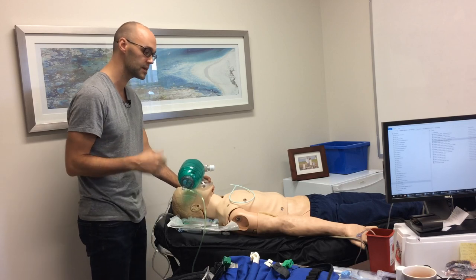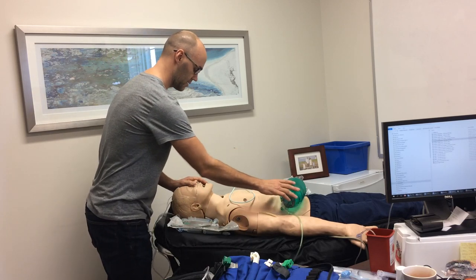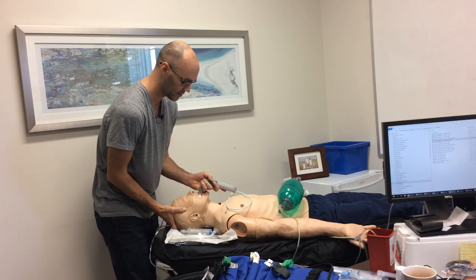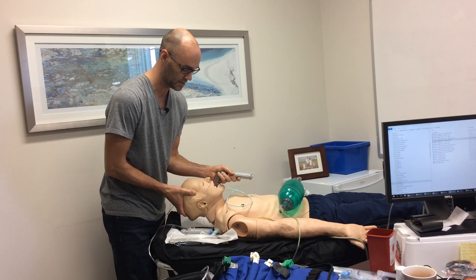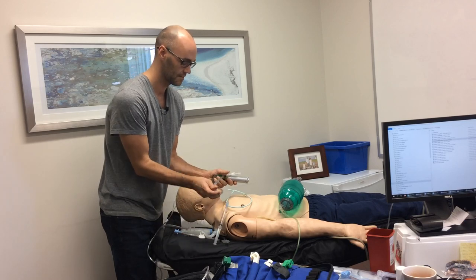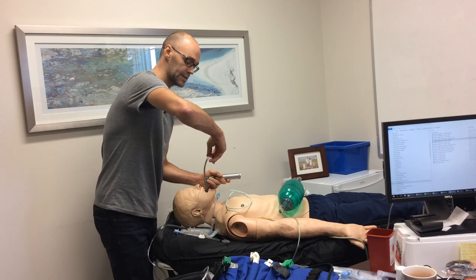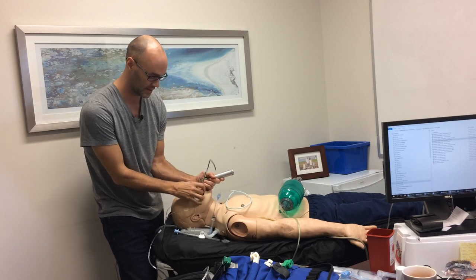Let's say that I see fasciculations about 30 seconds later and I feel loosening of the patient's jaw. I'm going to set my bag valve mask down, take the OPA out of the patient's mouth, and lay them down at a good level where I feel comfortable. I'm going to take my laryngoscope, advance my way down from the right-hand side of the mouth, working my way over until I can see the epiglottis, then try to engage the hyoepiglottic ligament, and get my assistant to pass me my tube. Then advance your endotracheal tube. When the tip of the tube is into the glottic opening, we'll want to have your partner take the stylet back about 8 centimeters so that we can advance the endotracheal tube into position.